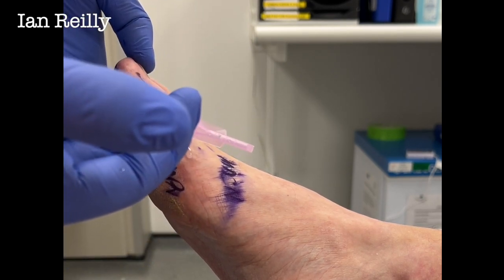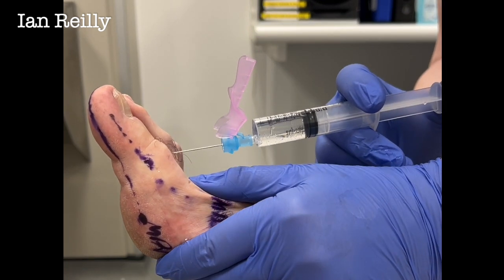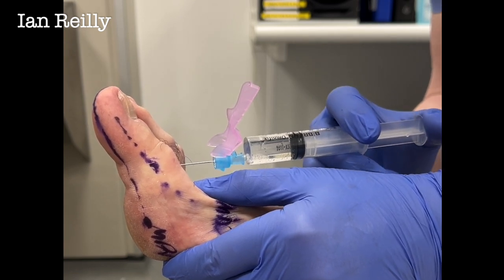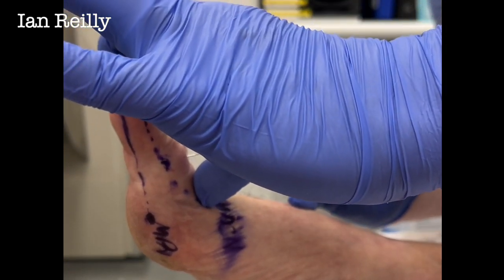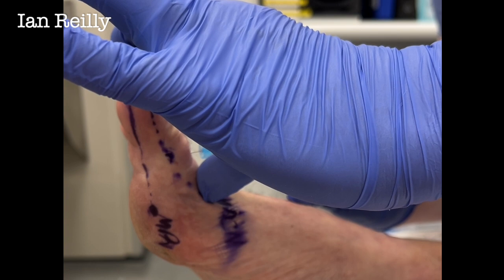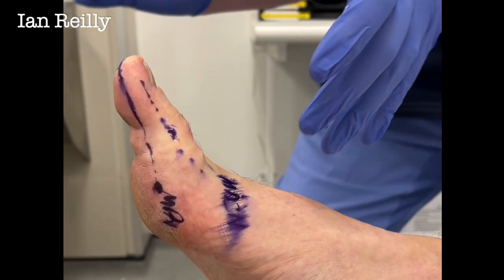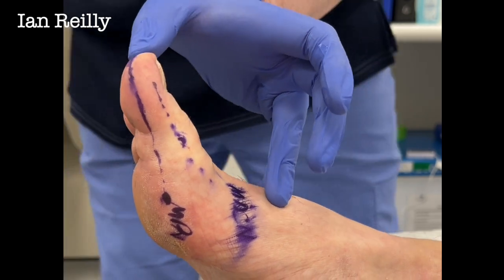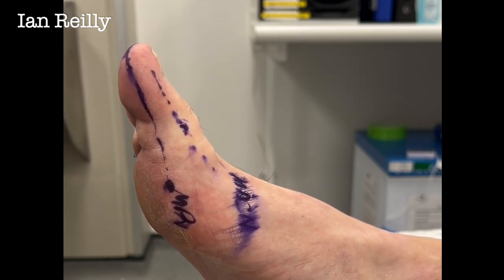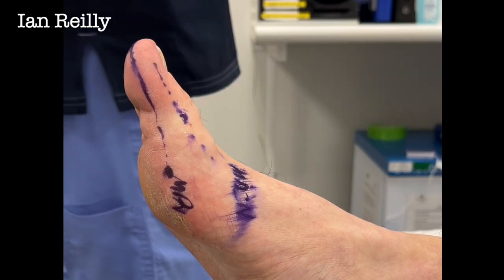Then for the lateral side — three, two, one, scratch. Dorsal lateral all the way down. I'll oftentimes just take that toe and work in 3D to visualise where the nerve is; as you get down to the bottom you'll get a few reactions. He's pulling a face but that's okay — he's laughing, which is a good sign. It looks quite good; it's a little bit blanched underneath, which is really where you want that local anaesthetic. That is our digital block. Safety needles — we love these.